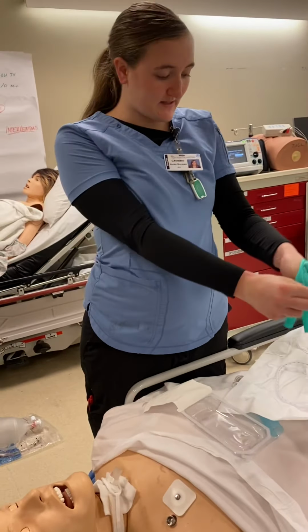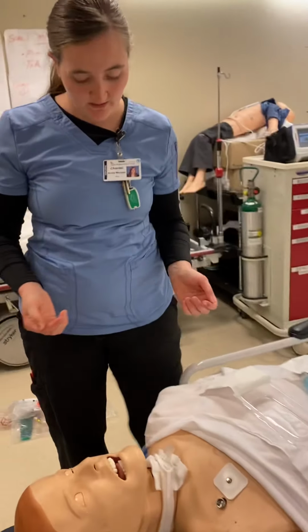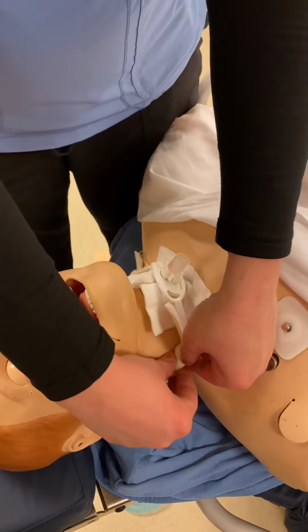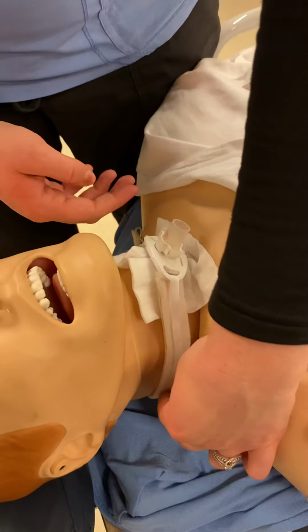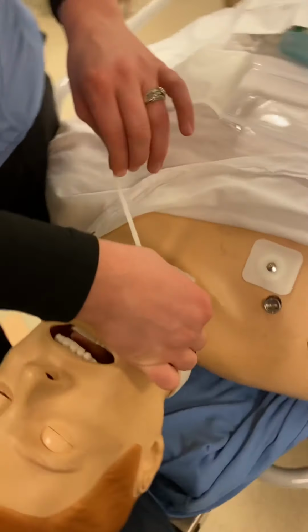And then the last thing is, if you wanted to change out your trach ties, these only need to be changed when they're soiled. A few things to keep in mind. If this is not sutured, your trach ties are what is holding this in place. They can either be ties or these nice foam holders here. So this is usually done with 2 people, because once you undo this, again, that's not secured.